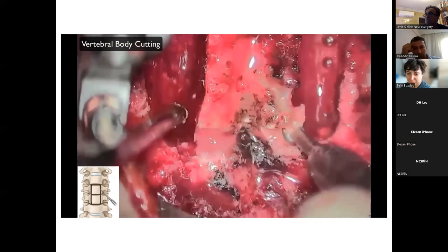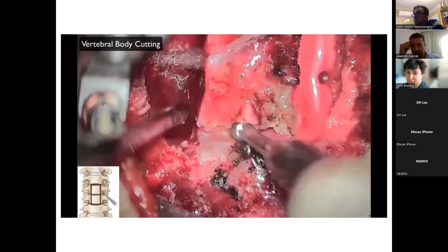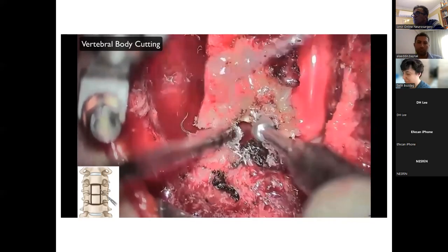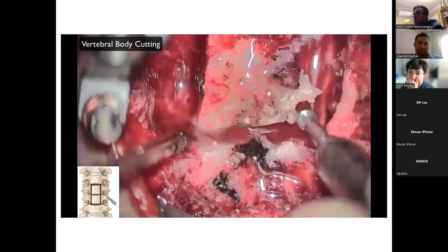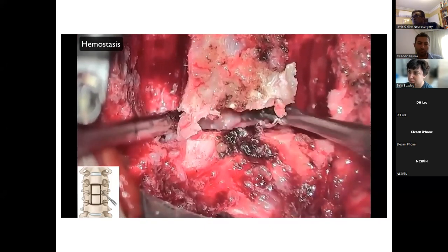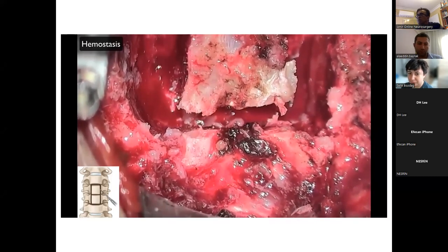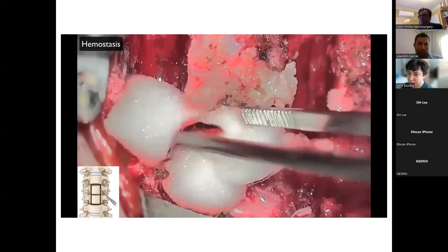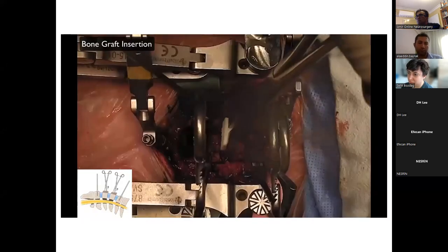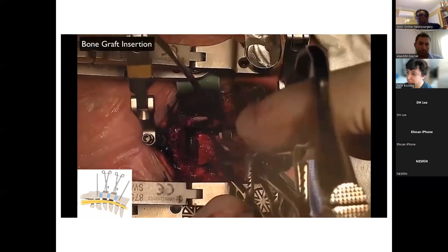By using a 2 to 3 millimeter high speed burr, two parallel longitudinal slits are made along the medial borders of the uncinate processes. The uncinate process is a landmark in this procedure, and lateral slits should be kept medial to the uncinate process, since making slits lateral to the uncinate process would risk the vertebral artery. Hemostasis is achieved by applying bone wax and using additional hemostatic agents.